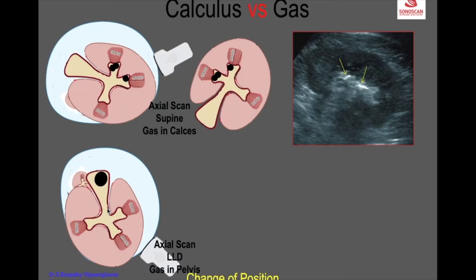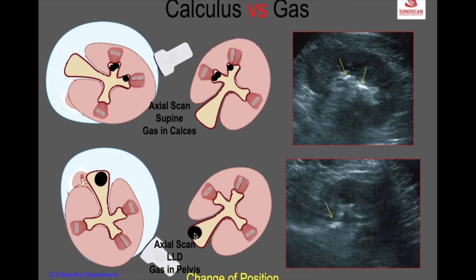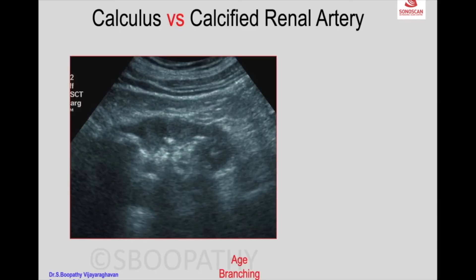If you change the position, the gas moves to the non-dependent part — that is, the renal pelvis. Because we do the scan from here, the image will appear up here and the gas will be in the renal pelvis. It has moved from the calices to the pelvis, confirming that it is gas and not a calculus.